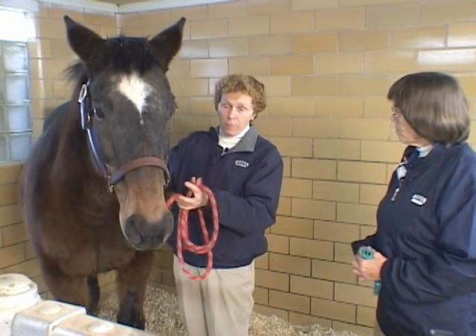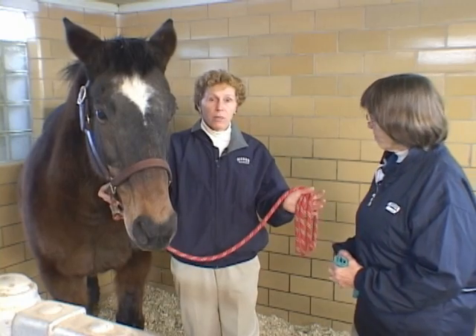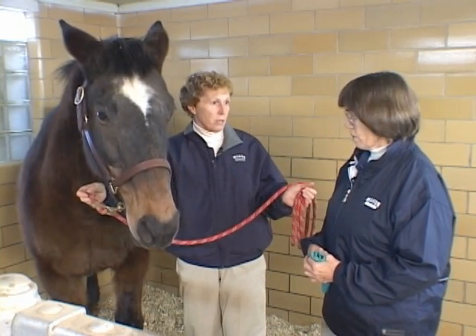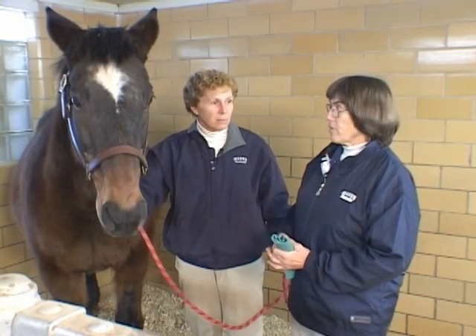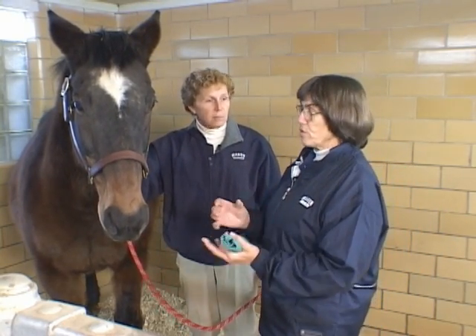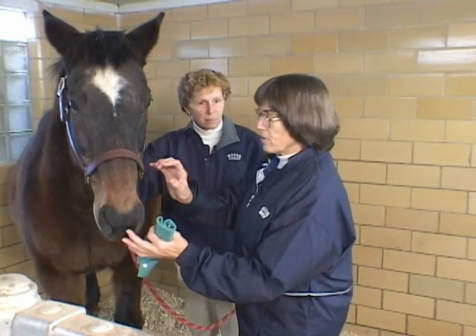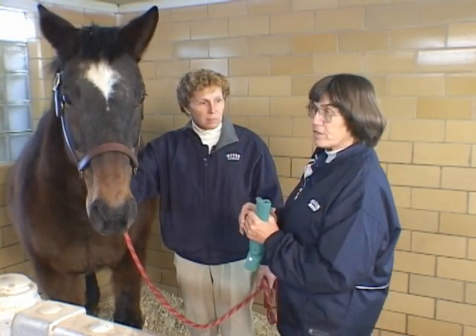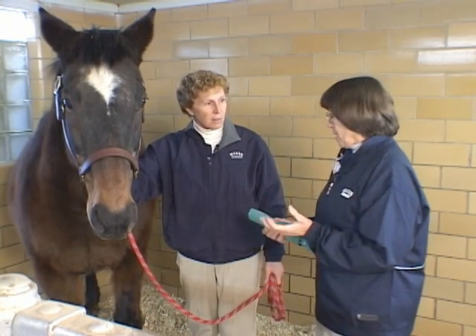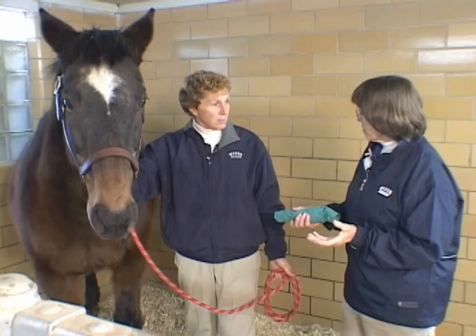Of course, they can rear up, and again, being on the side is the best place to be. A certain amount of head flinging goes along with this too. You always have to be sure that you're not getting so intent on your work — whether passing the tube or the tech — that you start to get your head up close, because horses are so fast and the head is so hard.